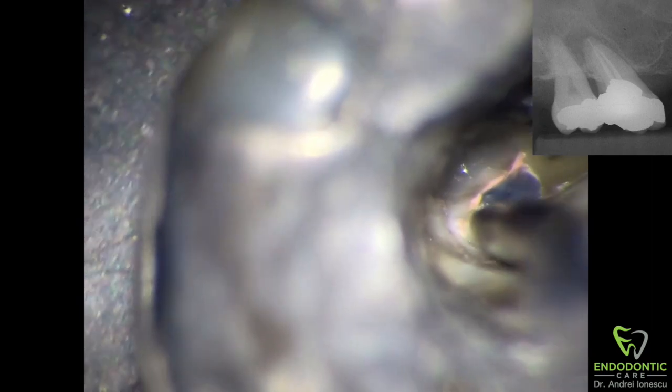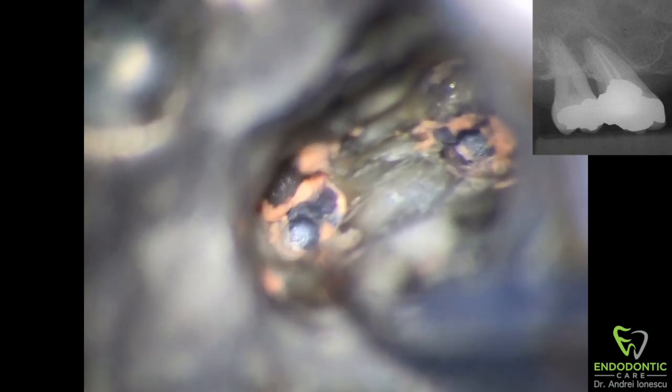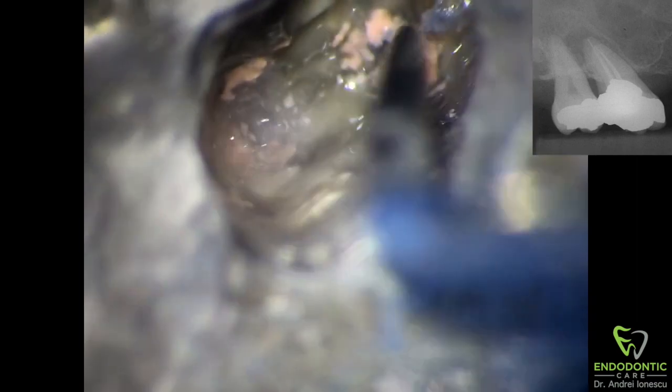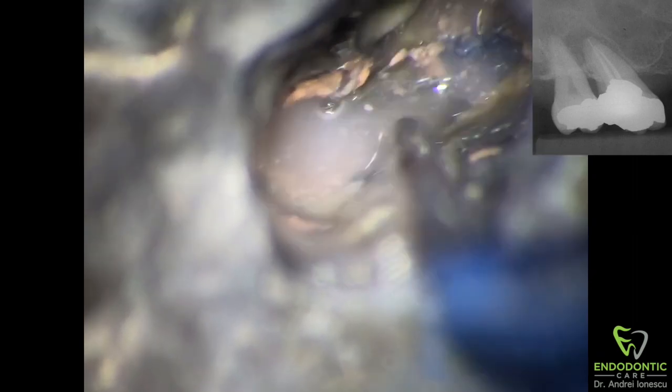I usually start off by using a heat plugger — in this case the System B — set to about 300 degrees, and I just melt a little bit of the gutta-percha coronally. I find that this allows the chloroform retreat solution to penetrate a little bit further down the canals and it just kind of kick-starts the process. Once we get lots of retreat solution in there, I start agitating it with an explorer, really wanting to get as much into contact with the gutta-percha as possible, making sure it's going into the canals as far as possible.